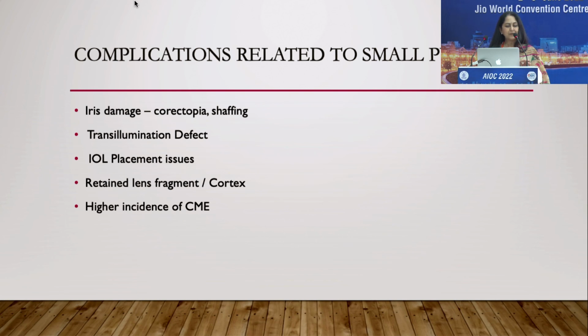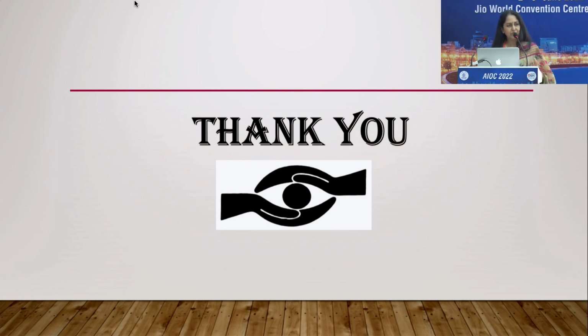There could be retained lens fragments or cortex. Now, regarding retained lens fragments, one thing I would like to say is always hydrate the ports before leaving. Because sometimes it's just in the side port that one of the nucleus fragments is hiding, or in a small pupil it could be under the iris, which may later cause a CME or a glaucoma or other problems. And in any case where you've done a lot of maneuvering with the iris, there are chances of CME. So if the patient is not having a good vision post-op, do an OCT to check and treat the patient accordingly. Thank you very much.